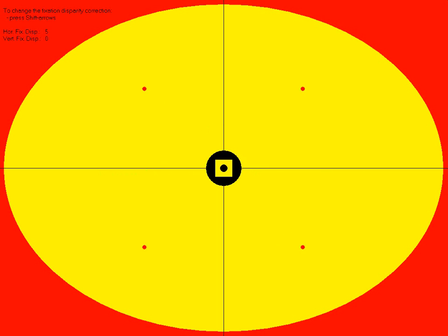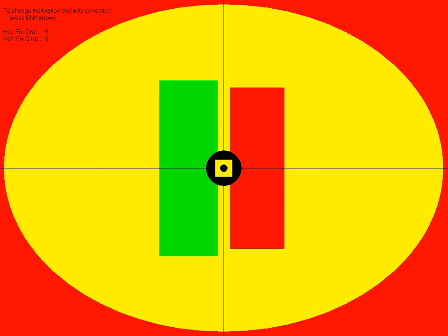As you can see, there are two rectangles, each visible to only one eye due to the red-green glasses. The patient's task is to compare the two rectangles and identify the one that he or she perceives to be the largest.